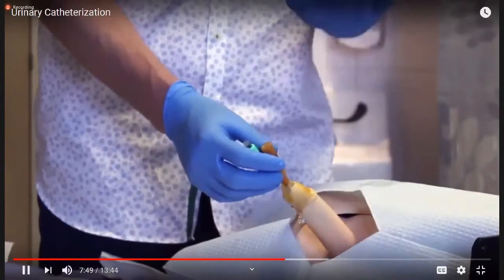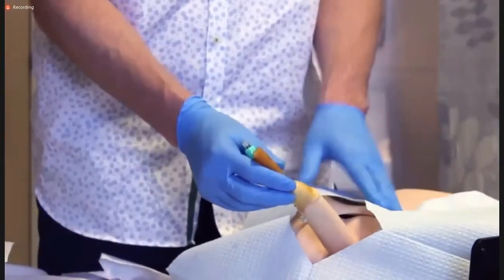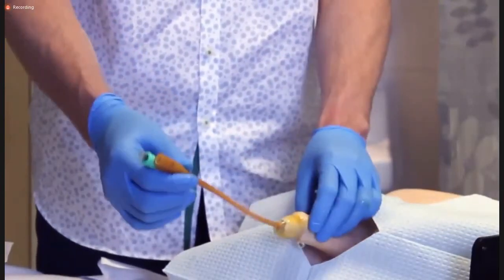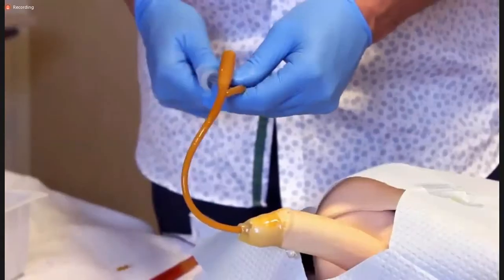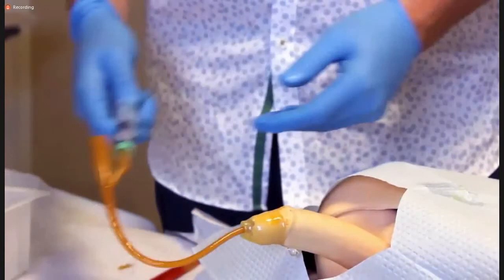Now, some people will, in fact, prior to inflating the balloon, push on the bladder, make sure there is urine. But then once you know you're in the bladder and the balloon is inflated, you pull the catheter back, you'll feel the balloon pull, and then you'll be able to drain the bladder of urine. When it's time to take your catheter out, place your syringe, deflate the balloon, and remove the catheter.